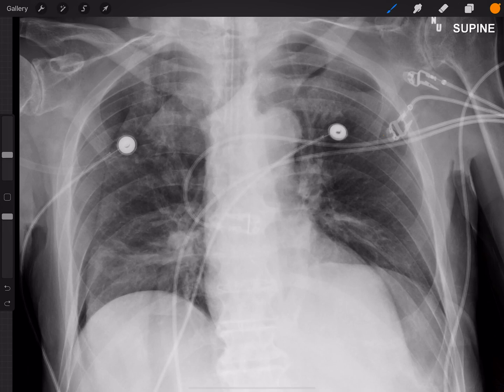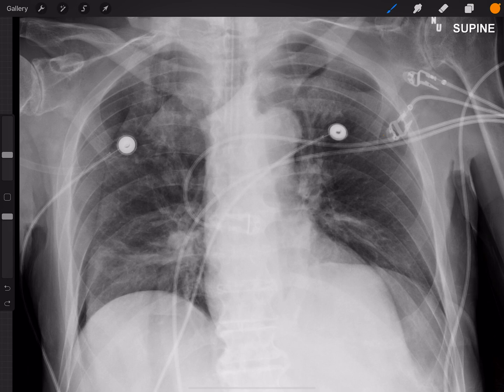Hey everybody, this is Rishi Agarwal and in this video I just wanted to show you a quick case that I see really commonly, but people make mistakes on it over and over again. Clinicians will misdiagnose it, residents will misdiagnose it, and even occasionally radiology attendings will misdiagnose it. Take a look at this chest x-ray — imagine you're a radiology resident and the ED physician calls you because they're concerned about a pneumothorax on the right side. Would you call this a pneumothorax?